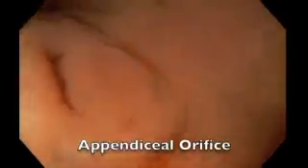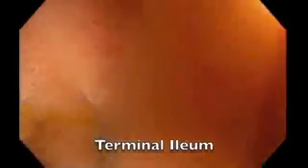In addition, various anatomic landmarks as well as gross findings are well visualized using the water technique. This is the typical appearance of the appendiceal orifice underwater, as well as the ileocecal valve and the terminal ileum.